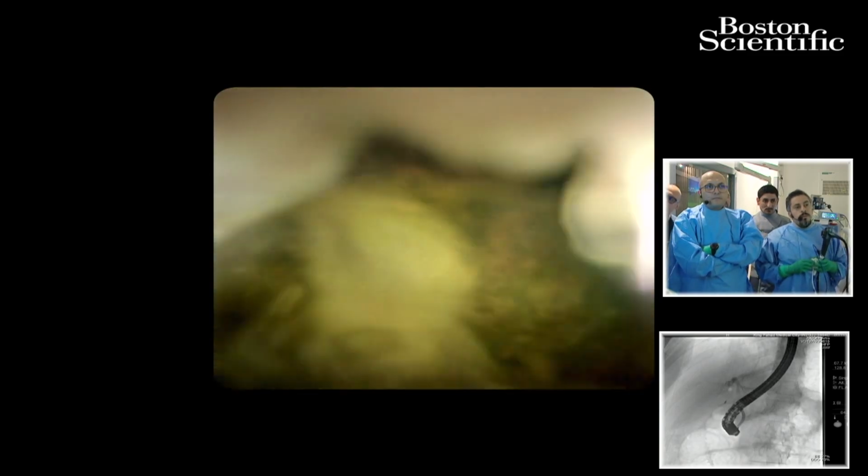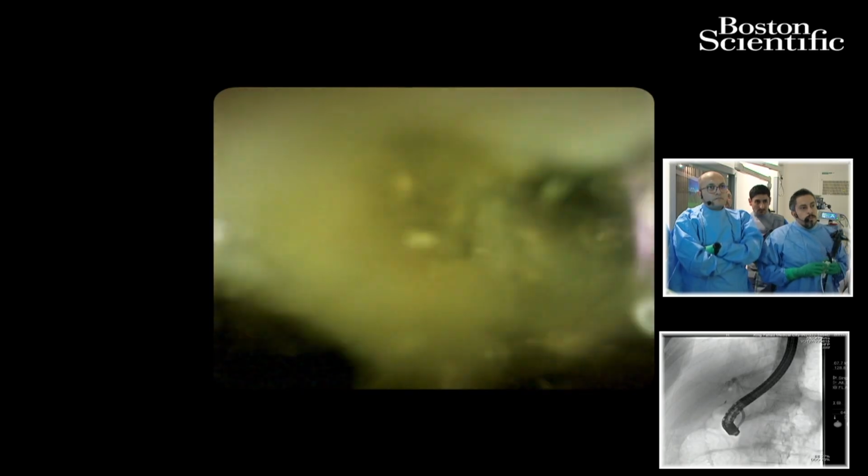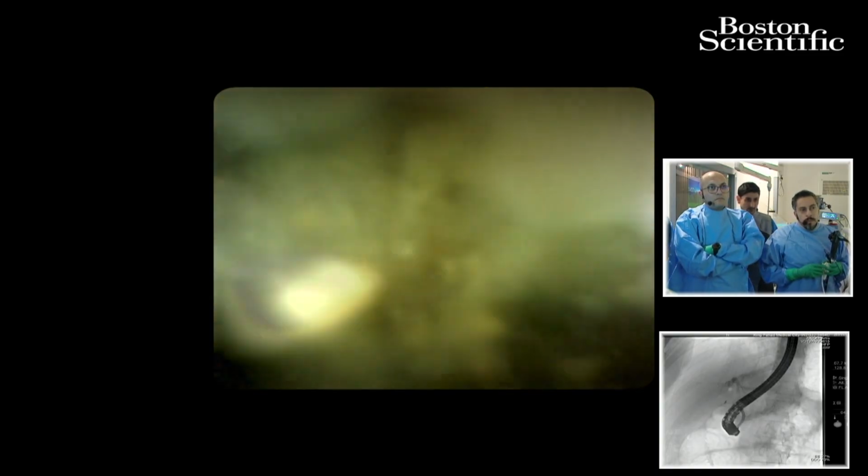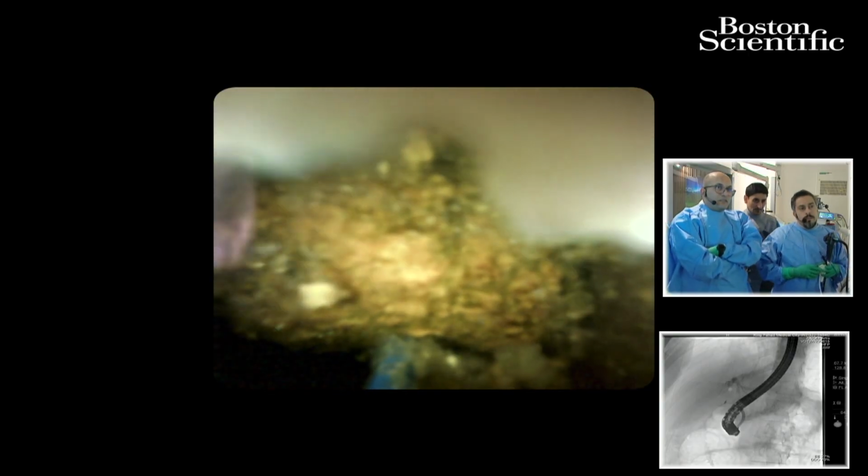So if I want to use SpyGlass and do the laser, they are stone formers. Their gallbladder is out and they have rocks there. How many sessions, how long can I do in one session, and how many sessions do you think are usually needed, if like this patient he has right hepatic and left hepatic duct stones behind this one? How many sessions do you need, and how long will you continue?